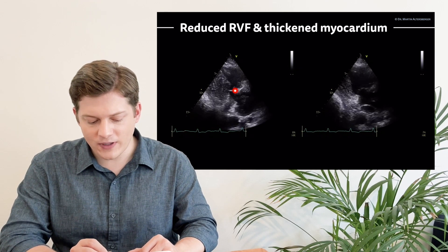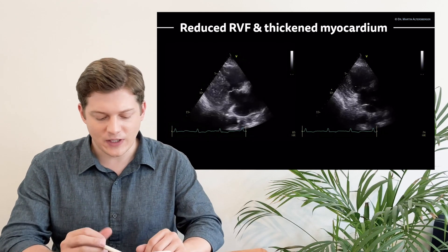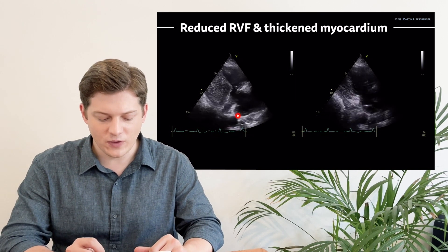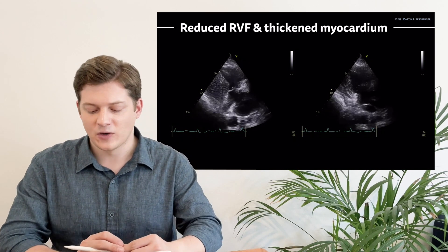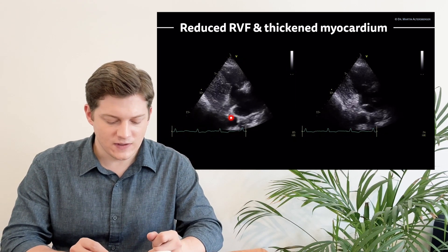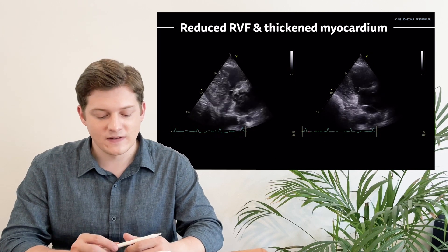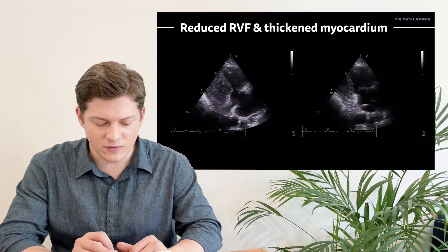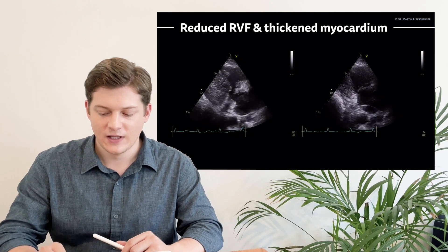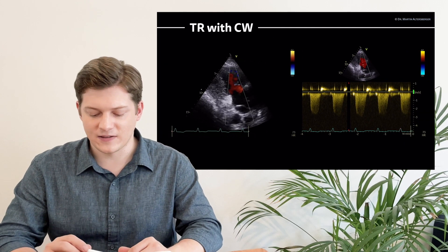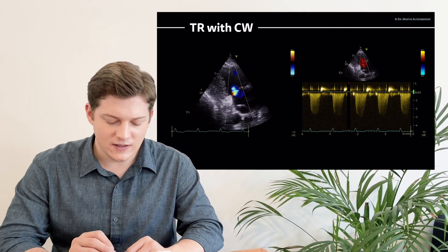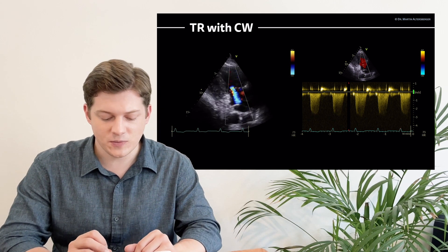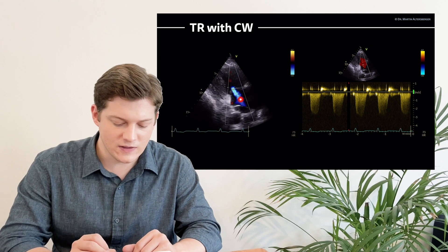In this view, the opening and closing of the tricuspid valve is entirely different compared to a healthy individual, and you can see that the inflow of the coronary sinus is more prominent. The inflow of the IVC over here is also more prominent compared to a healthy individual. This is probably the descending aorta. Both loops show that the anterior and the posterior leaflet of the tricuspid valve can be nicely differentiated. With color Doppler added, we can see the inflow into the right atrium and right ventricle, and also the tricuspid regurgitation.